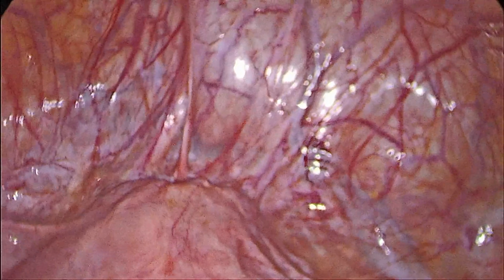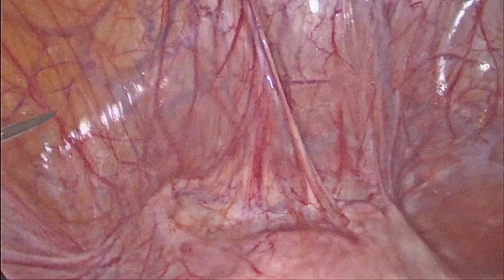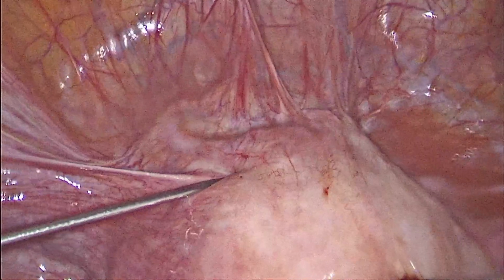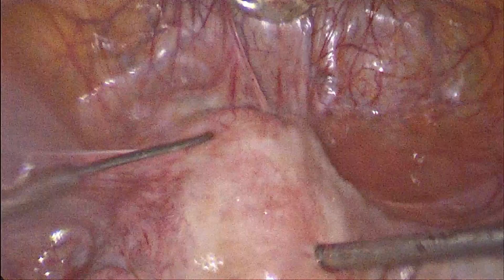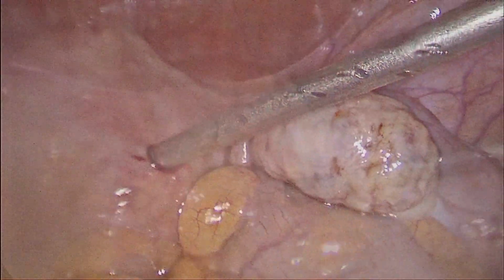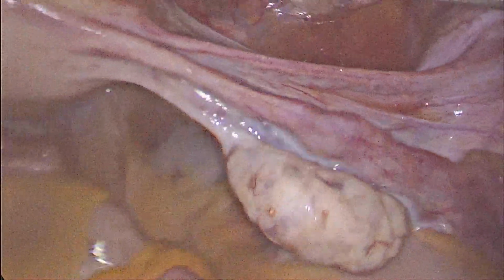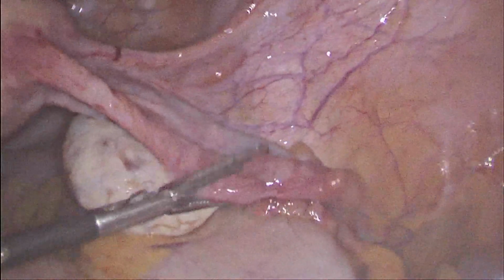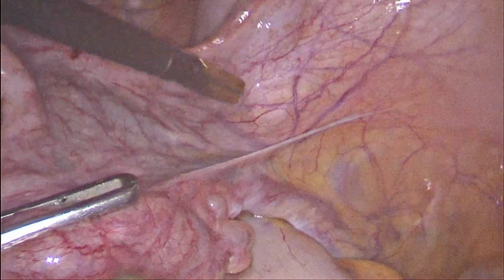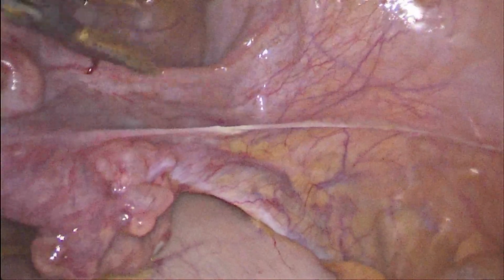Here we can see a dense puckered scar. The utrovesical fold of peritoneum is seen well deep inside the scar. Vasopressin is injected at the site of the scar to prevent blood loss. We also tried reversible ligation of the uterine artery on either side by the shoelace technique.